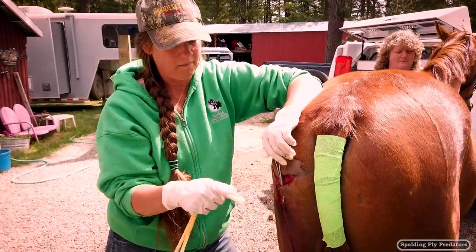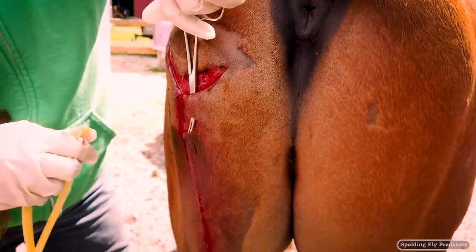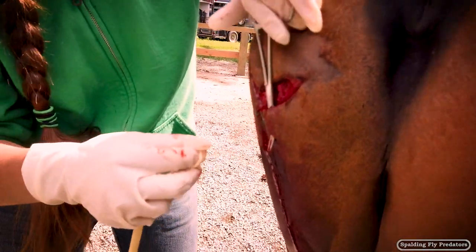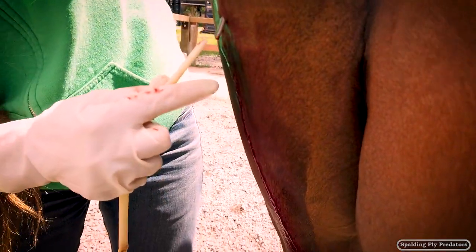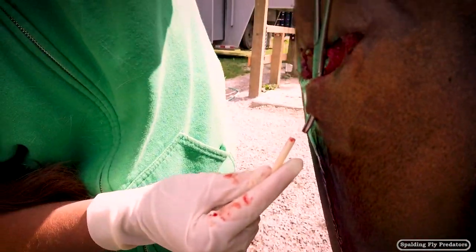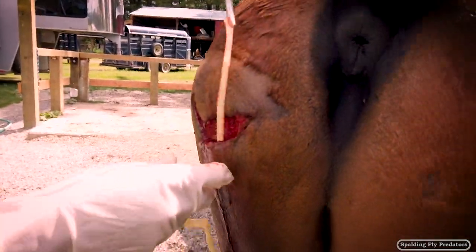We've made a little stab wound down at the bottom here, and this is where that drain is going to go through. So we're just going to pull the drain through the bottom of the wound by grabbing it here. If I can get this open left-handed — there we go. Pull it up that way. There we go.